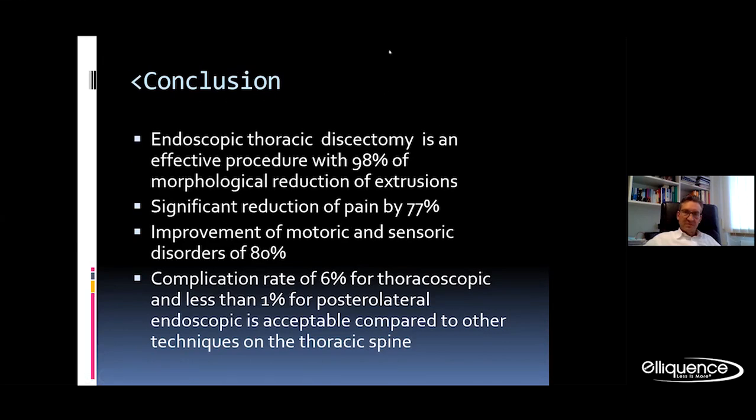Thank you very much, Dr. Hellinger. Excellent presentation, as always. I do see some questions that have come in from Dr. Sohail, and I do want to speak to the audience. If anybody does have any questions they'd like to ask to either Dr. Kim or Dr. Hellinger, you're invited to send in your questions into the Q&A or the chat, or raise your hand to speak to them directly. So Dr. Hellinger, this one comes from Dr. Sohail. What are limitations of endoscopic technique in the thoracic spine?